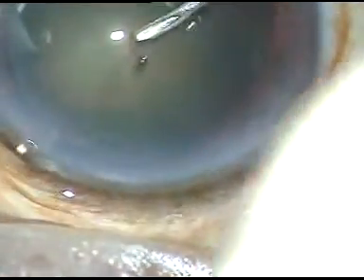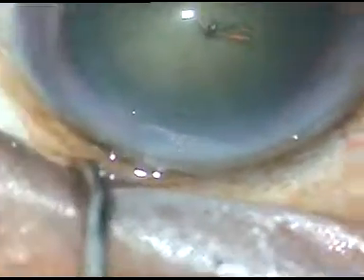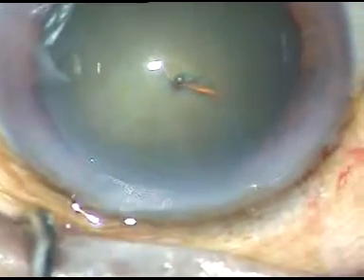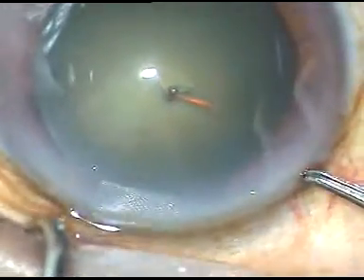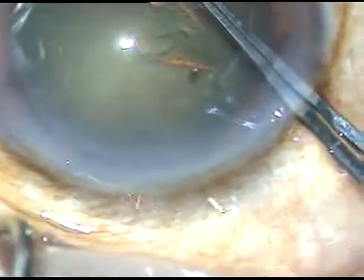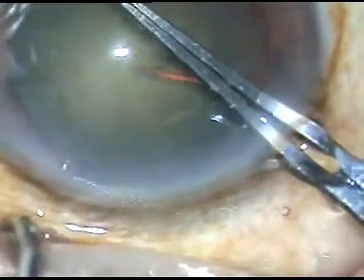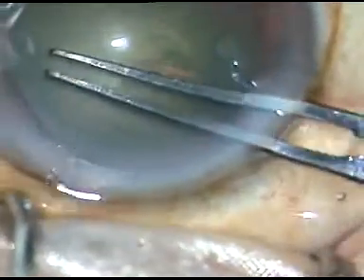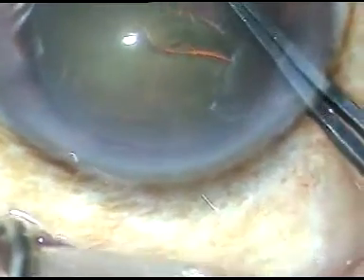Incise the anterior capsule with a 26 gauge bent needle. Now hold this flap with a Utrata forceps. Rest against the anterior lip of the main incision so that leakage of viscoelastic substance becomes very minimal, the antechamber remains formed, and you can complete capsulorhexis without shallowing of the anterior chamber.